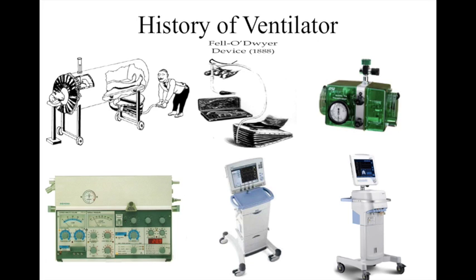Ventilator management protocols will be incorporated into the basic operation of the ventilator. Organized information will be presented instead of raw, unrelated data. The alarm system will be smart. Closed-loop control will be present on the most accepted ventilatory support, and decision support will be available. The key term that will identify this future ventilator will be smart, like the Servo-i and the G5.